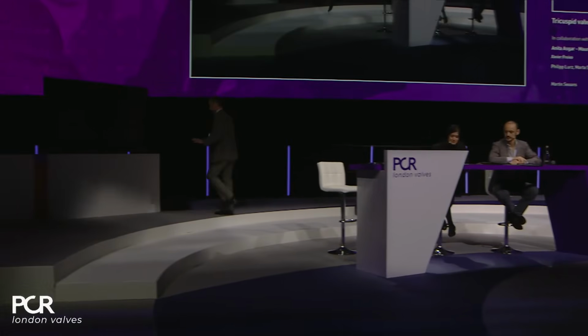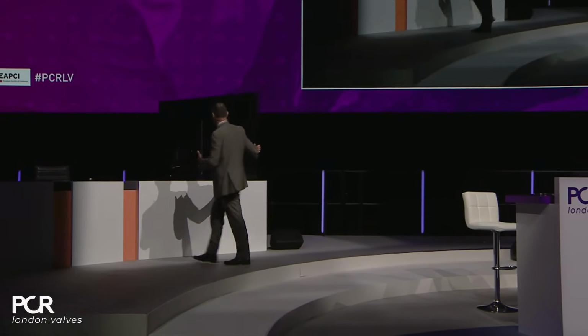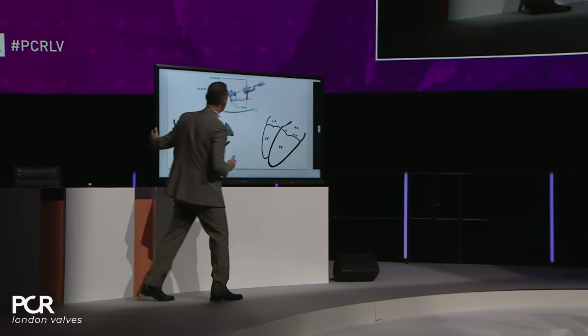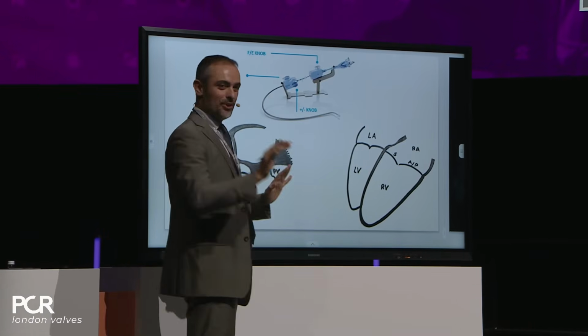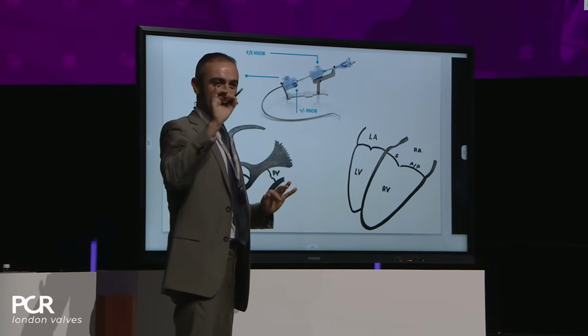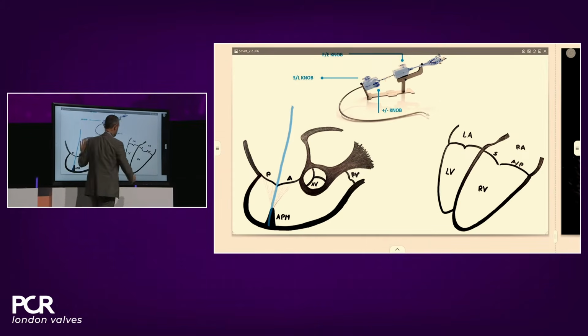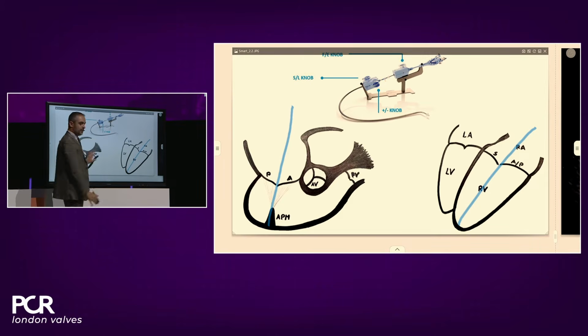We have the smart screen that I think is going to be very, very useful. And actually, I'm going to be, in a sense, repeating, but I'm repeating on purpose because I consider what we're saying so important. So, two things really important: axial alignment, to be in this axis, inflow, outflow, and in this axis, long view. So what do we do to get this?